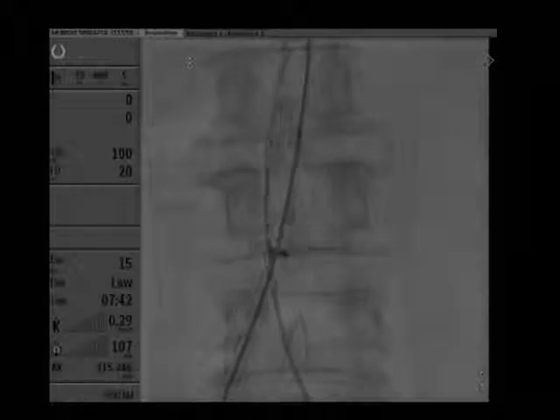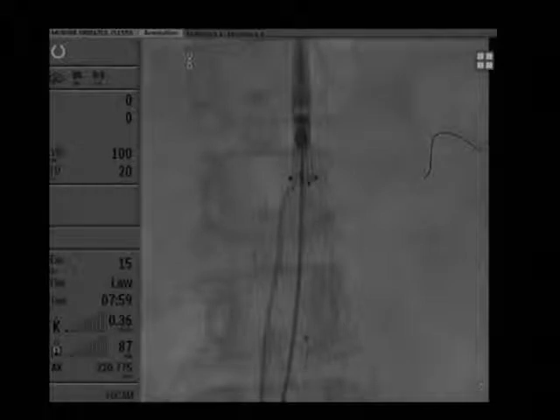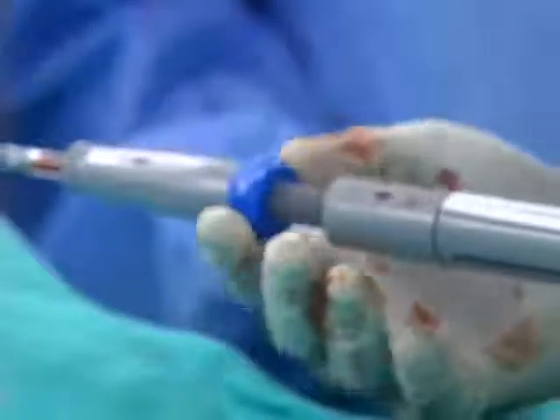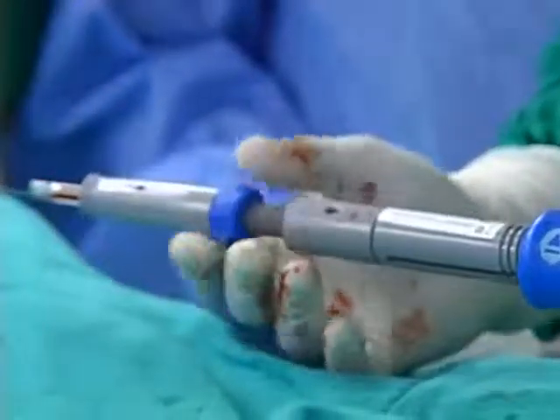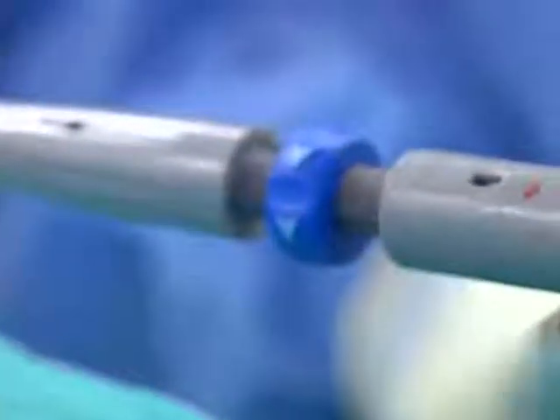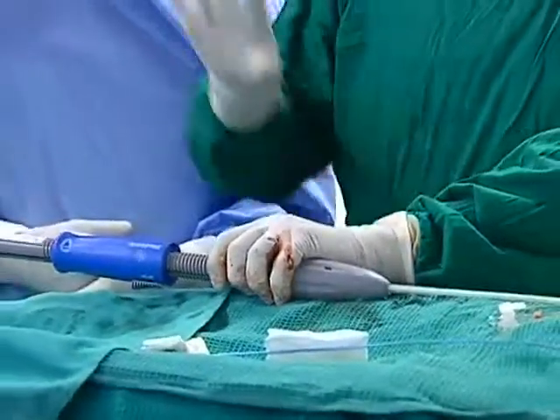At this stage we could finish the release of the top of the device. Just a bit of a test there, just to make sure we are all right. Okay, so I'm going to release the top. Now there is a round knob here which is also blue, and you have to rotate it in the direction of the arrow that's on it. So here I go. I'm rotating it, and that should open the top. So that opened the top. You can see that. Acquire that, please. Now this is the free flow part of the device, and it has barbs on it, and this digs into the aortic wall, and then it prevents migration of the device downwards.